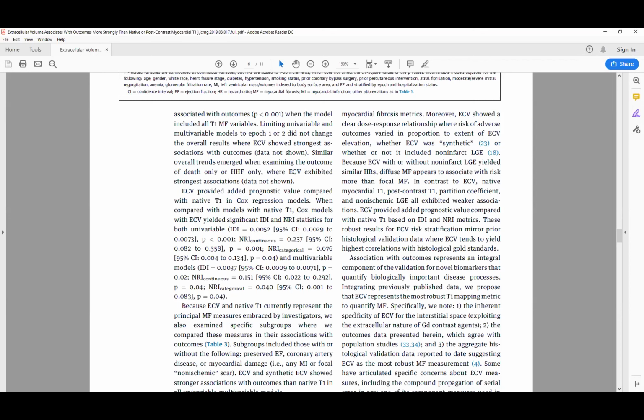Yes. With your experience. Yeah, I only look at native T1 essentially when I don't have ECV, and I use it as a screen for hemochromatosis and Fabry's disease. But otherwise, I have major concerns about whether the scanner isn't properly shimmed, or if there is anemia.